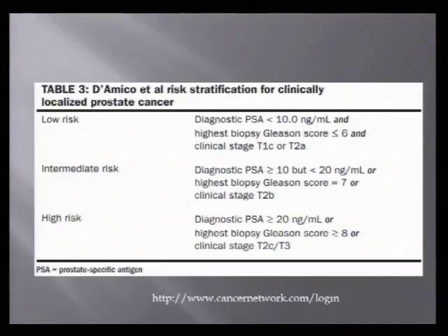there's one thing that's interesting in prostate MRI: clearly risk is an important thing. In all cancer, it's important, but in determining what you're going to do, it's a little bit different, in my opinion, than when you look at breast cancer and all this different stuff. I think a lot of times with breast cancer, you just see that there's a cancer, you biopsy it as a cancer, and I know that there are differences in what we do based on histology and everything, but nowhere near what it is with prostate MRI.